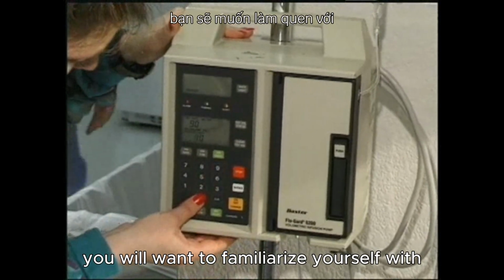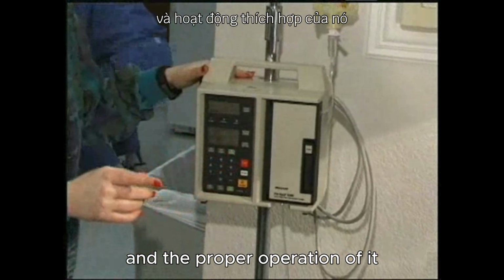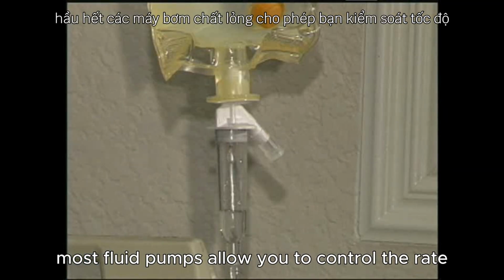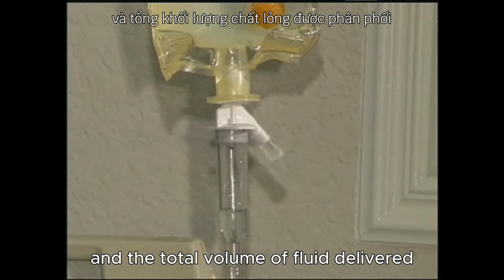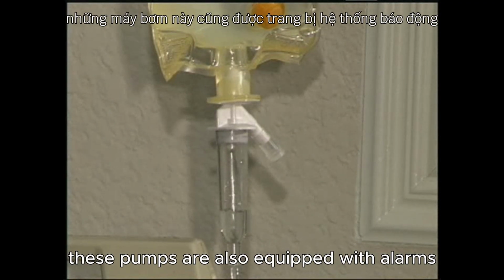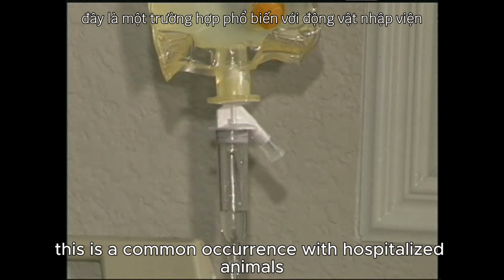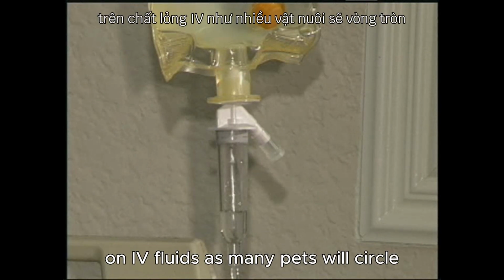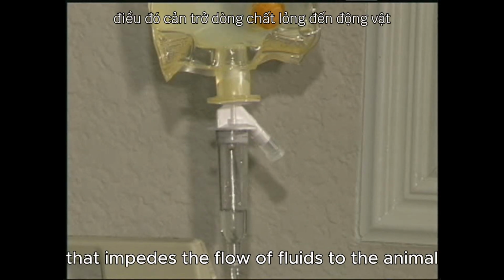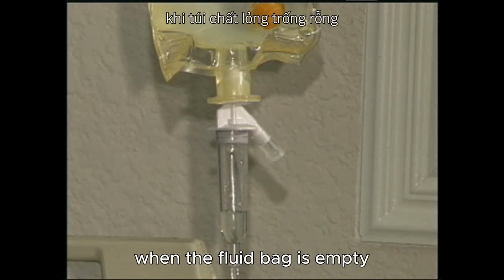You will want to familiarize yourself with the type of pump you have in your facility and the proper operation of it. Most fluid pumps allow you to control the rate and the total volume of fluid delivered. These pumps are also equipped with alarms that notify you if fluids stop flowing for any reason. This is a common occurrence with hospitalized animals on IV fluids, as many pets will circle or get into a position that impedes the flow of fluids to the animal. The alarm also notifies the caregiver when the fluid bag is empty.